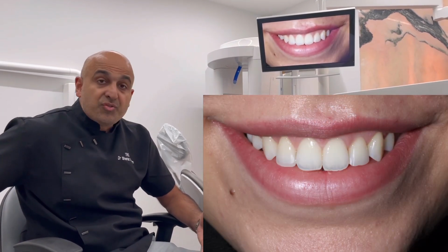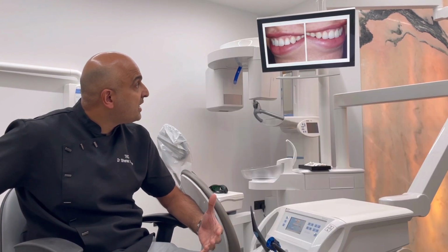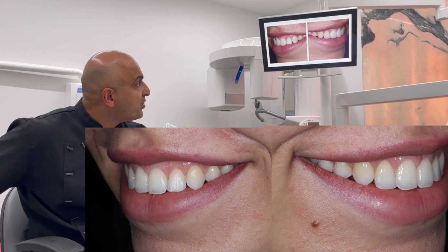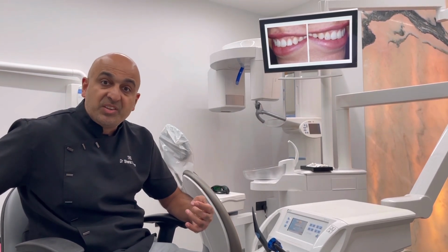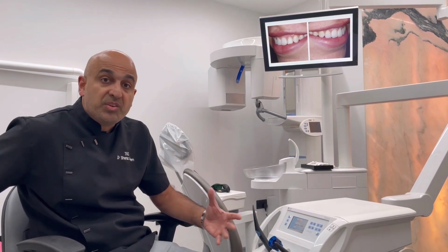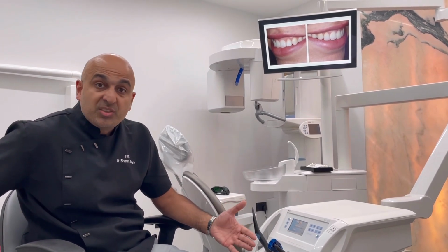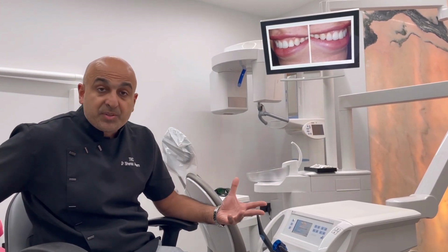Then at the end of the treatment, we were able to do a bit of composite bonding on each individual tooth, and I'll show you this in more detail here. We were able to do some composite bonding with a little bit of laser recontouring. The patient was very happy because one of the big issues was that the teeth were looking quite short, so we were able to correct that. The other way to tackle a case like this would be to do some non-prep ceramics. Because the teeth are quite short, you could do some ceramics, which we do a lot of, and bond that on top. The advantage is that they last longer and look a bit more aesthetic. But in this case, composite bonding worked absolutely fine for a young patient.